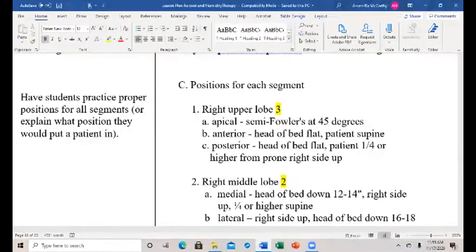So on the lab, you guys are going to have to show me the different types of nebulizers, the different types of humidifiers, right? And show me the percussion devices or whatever airway clearance device I ask. So I may say, okay, I want this group to drain the superior segment of the left lower lobe, right? So you and your partner would turn your patient to do that, okay? I may say, show me how you would explain PEP therapy to somebody. You would tell them, I want you to take a deep breath in and blow out normal against this force, telling them what it's doing for them. PEP device is getting air behind the what? Secretions in the alveoli. And then after they get it, they follow by 3 huff coughs. That's how you have to be able to explain it. As long as you can explain it and show it, that's a checkoff. That's how you get checked off.